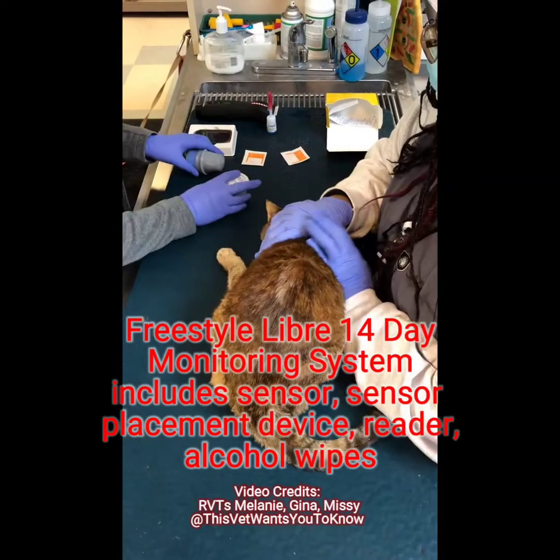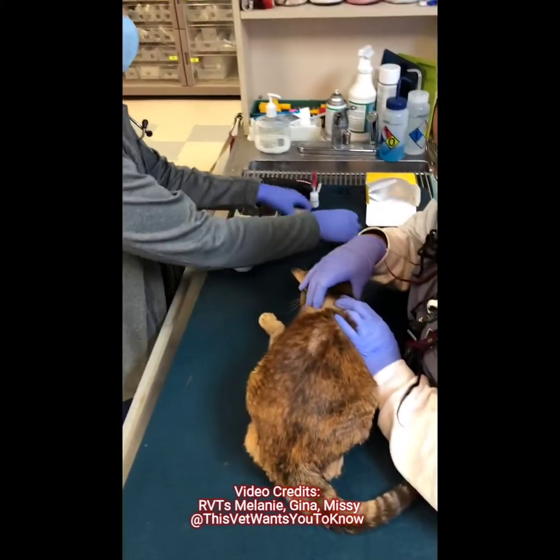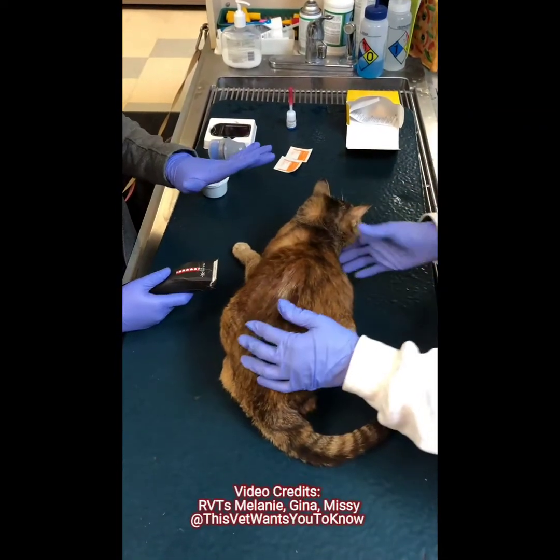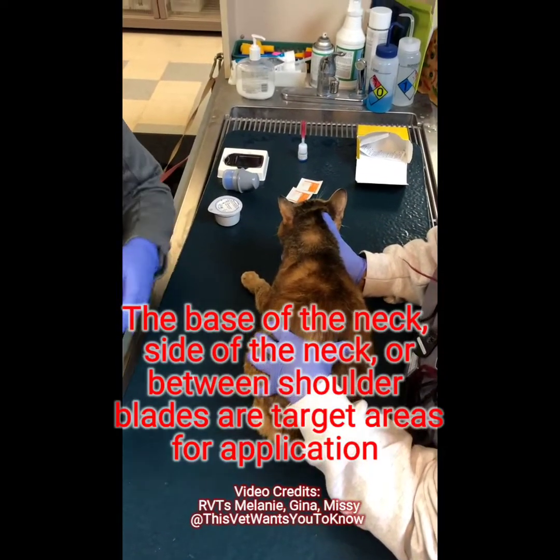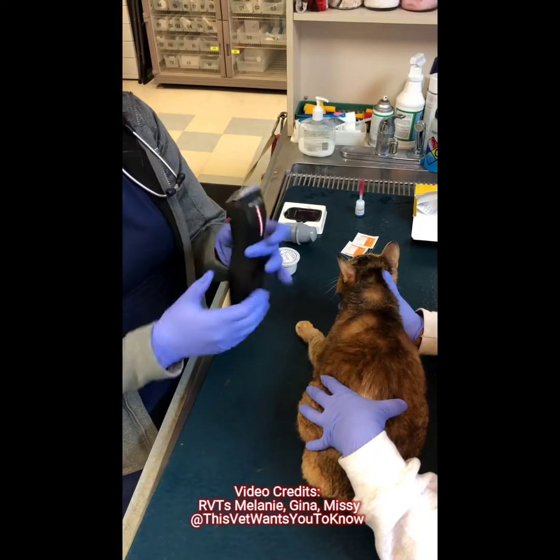This is everything that comes in the box of the FreeStyle. It comes with two pieces that we're going to connect together, and these are alcohol wipes just to clean the skin. We're going to start by shaving a nice flat spot for the reader to stick to — usually I like to use the neck, it works really well. These are the kind of clippers you want to use, just typical hair trimmers without the guard on them.